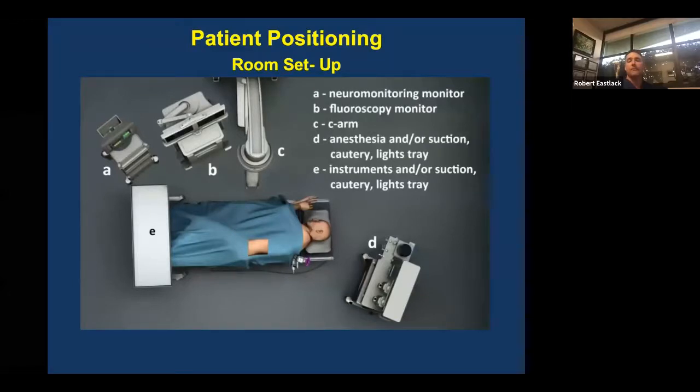This is the setup. It's easier to have the fluoro on the far side of the patient because the intensifier, once you roll onto the lateral position — the C-arm is in what you would typically think of as lateral, coming under the patient to get an AP view — will be in your way more if it comes in from the patient's backside. Generally, we set it up based on how the room is best arranged relative to the entry door, but if you have your choice, this is a little easier ergonomically for the primary surgeon who tends to be working on the dorsal side of the patient.